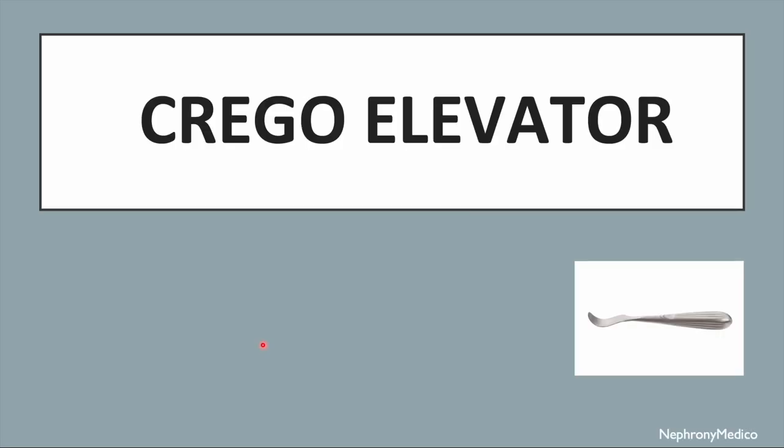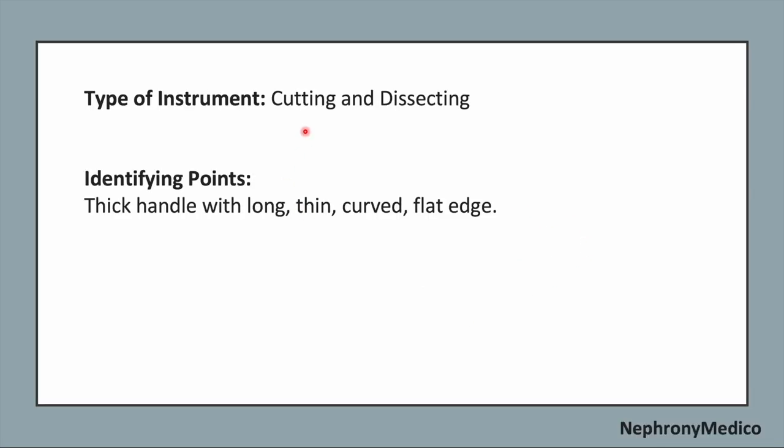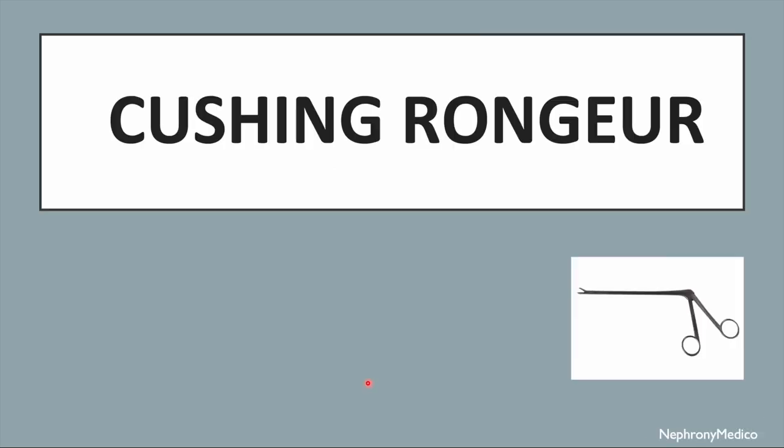Let's talk about Crego elevator. This is a picture showing Crego elevator. It is a cutting and dissecting type of instrument. Identifying points: the thick handle with a long, thin, curved and flat edge is the identifying point. Use: it dissects or separates tissue and retracts tissue. Inspect the edge for nicks to ensure sharpness.